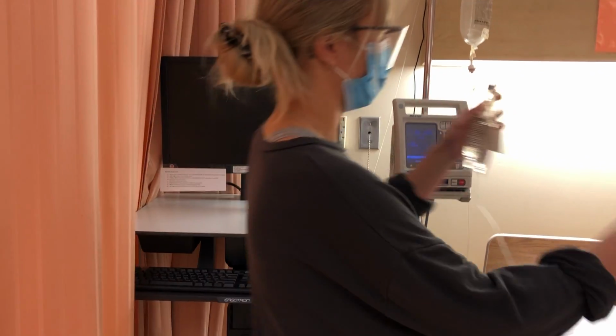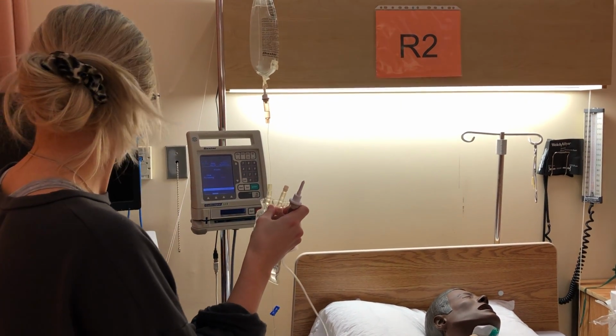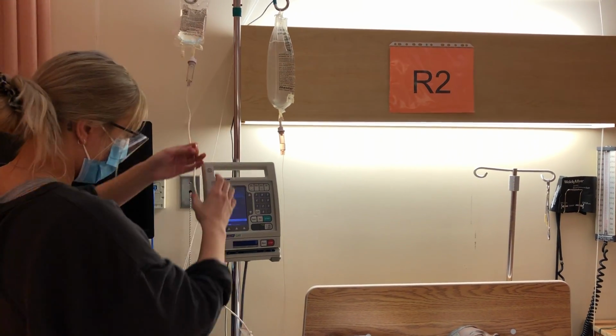And I can spike the bag. But again, it's at a slow rate, so that will take a while. But I'm going to be here for 15 minutes, so we're going to keep an eye on that, making sure I'm remaining sterile. After 15 minutes, I'm going to be changing the bag. So while it's running at 50 milliliters per hour, hang the med.